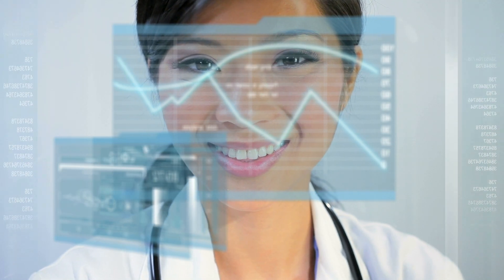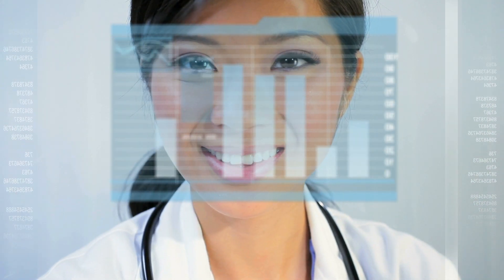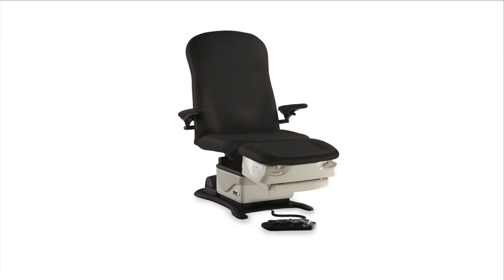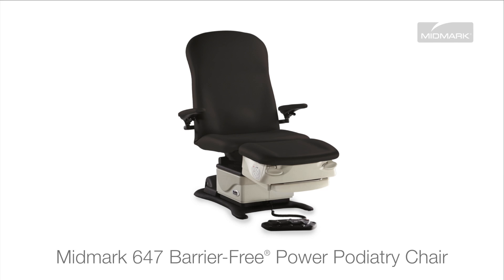As health care continues to evolve, it is essential to keep pace so you can move your practice confidently into the future. Midmark can help. The Midmark 647 Barrier-Free Power Podiatry Chair is the next step in foot and ankle care.